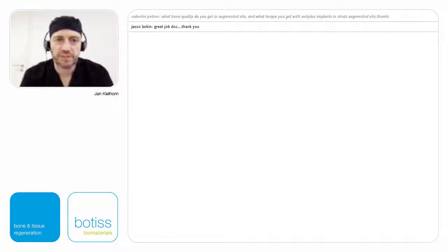So, first question is from Valentin Petrov. What bone quality do you get in augmented site, and what torque you get with Ankylos implant in struts augmentation site? Well, the bone quality we get is about a D2 bone, I would say. It's not as soft as a D4 bone, which is good. It's about a D2 bone. The Ankylos, I try with all my implants not to get more than 30 Newton centimeters, because I don't want to stress bone too much.